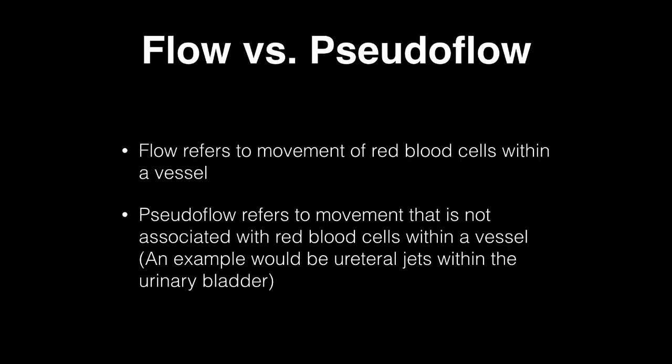In the last slide, I used a couple terms I want to make sure that we're all on the same page with. One is flow versus pseudoflow. Now, from a purist standpoint, flow refers to movement of red blood cells within a vessel, while pseudoflow refers to movement that is not associated with red blood cells within a vessel. An example of this would be assessing with Doppler the ureteral jets within the urinary bladder.